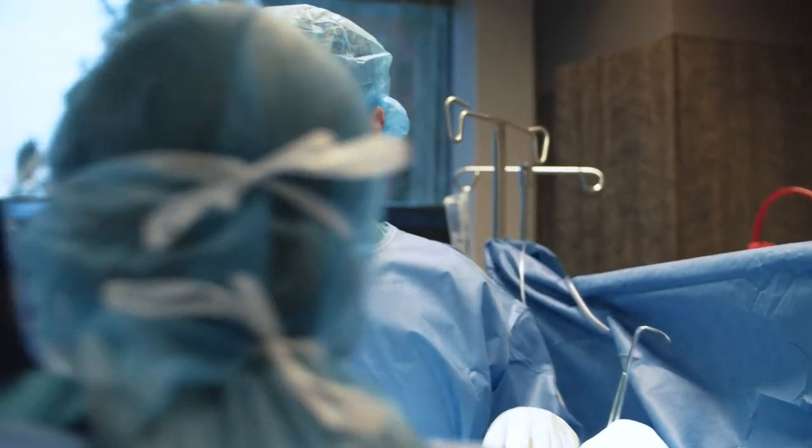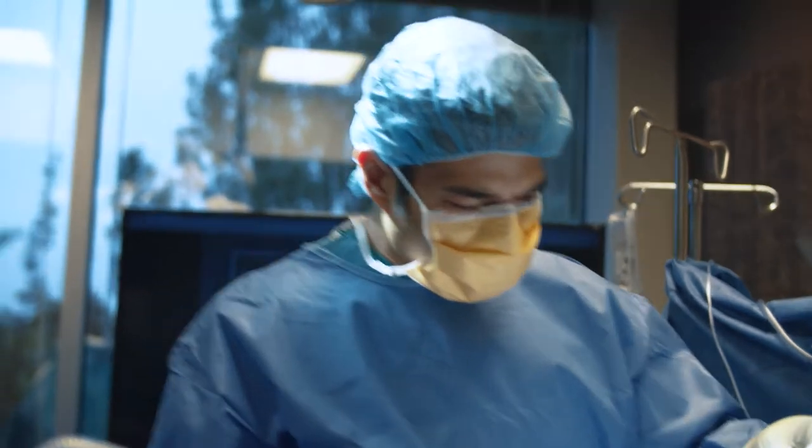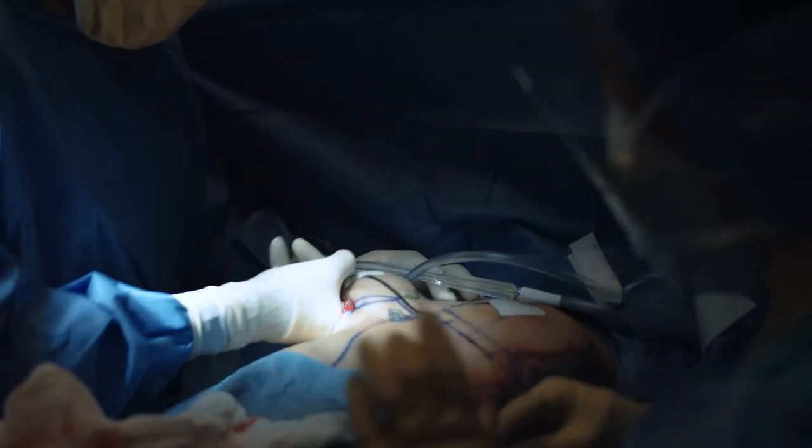All right, now we are going to go underneath the muscle. So I have the muscle grasped, and we're going to go underneath here with our special curved scissors, like that. Now I'm going to open the pocket gently with my finger. I can feel, I'm right above her ribs, and I'm opening up the submuscular pocket.